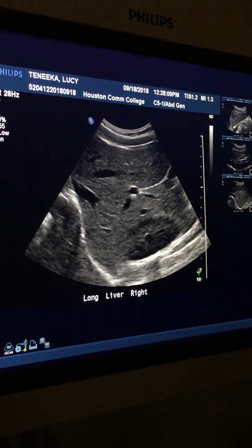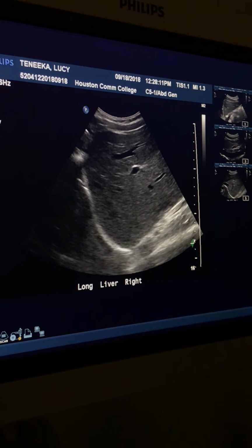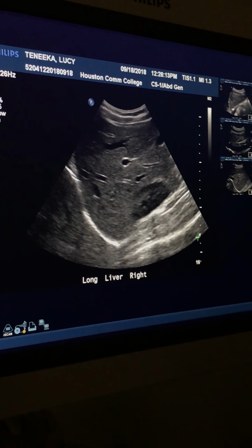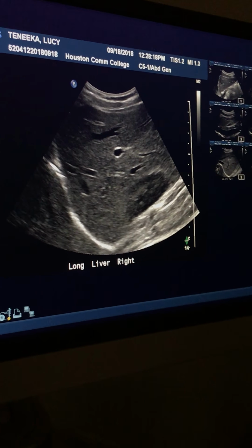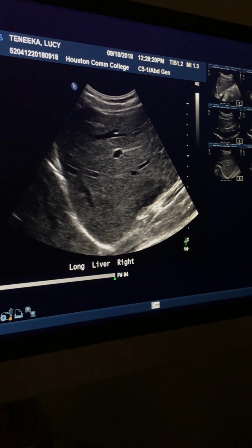I would definitely decrease my... No. I'm going to heel down. I'm going to slide down her a little bit. That one's not bad. Heel down a little bit. I'm going to leave it there. So that also can be right portal vein.